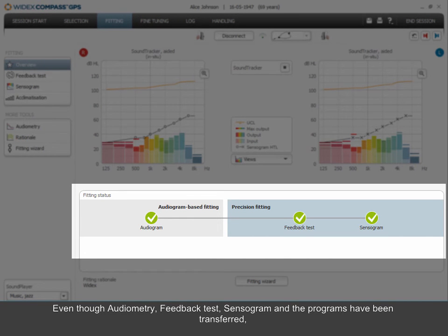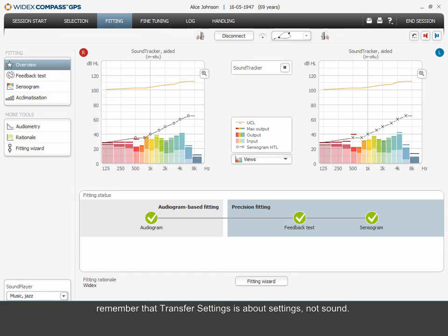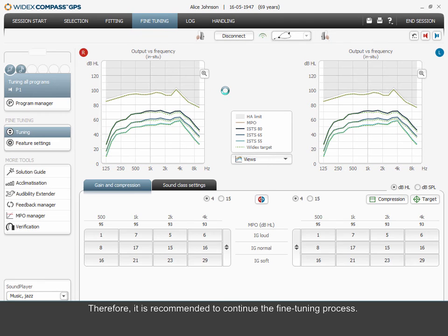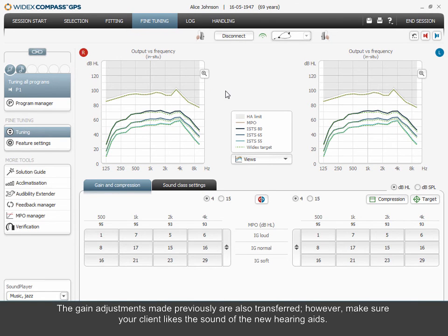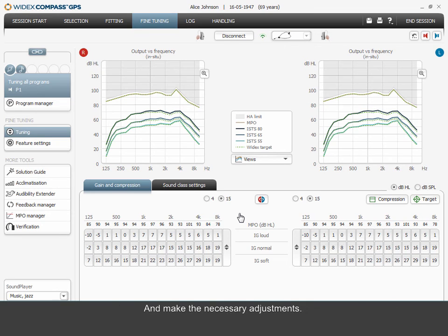Even though audiometry, feedback test, sensorgram, and the programs have been transferred, remember that transfer settings is about settings, not sound. Therefore, it is recommended to continue the fine-tuning process. The gain adjustments made previously are also transferred. However, make sure your client likes the sound of the new hearing aids and make the necessary adjustments.